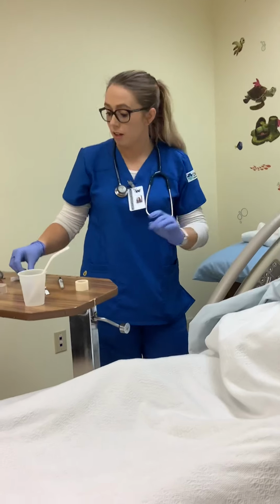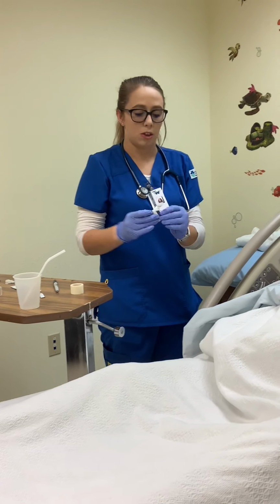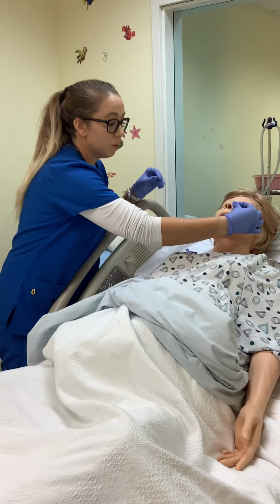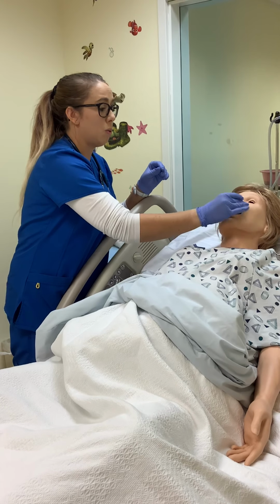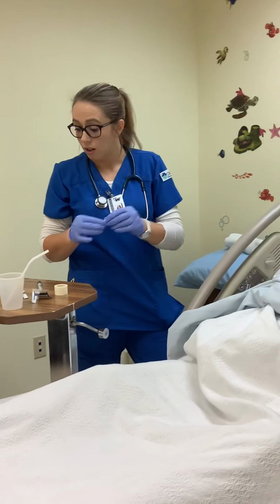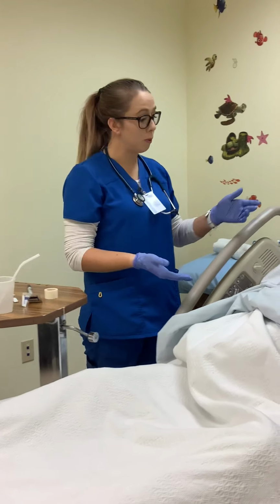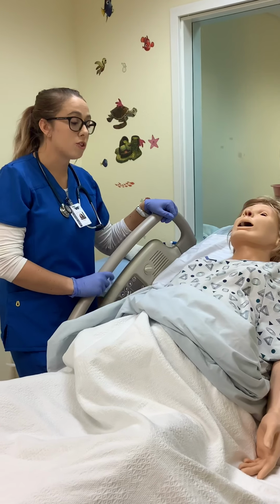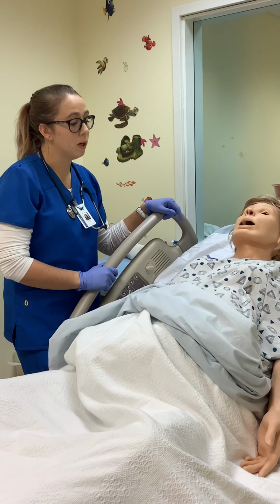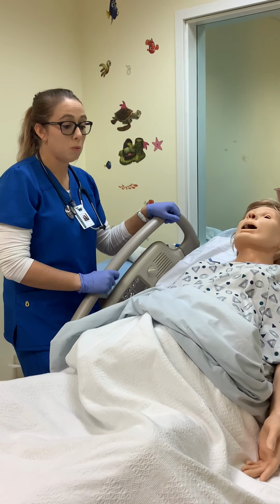Okay, after that, you would take a washcloth or a towel. I'm just going to do an alcohol swab and clean off their nose, as well as ask them if they want a washcloth to wipe their face. After that, I would ask the patient if she needed help with any mouthwash, brushing her teeth, getting that taste out, as well as asking her if she wanted water.